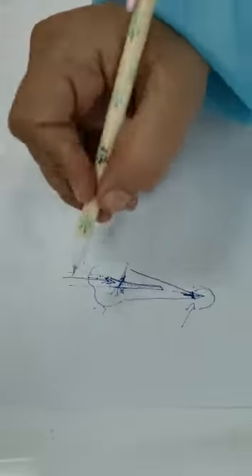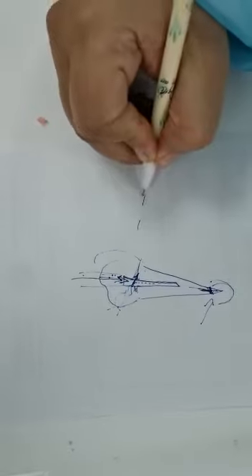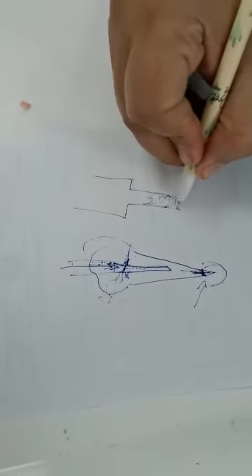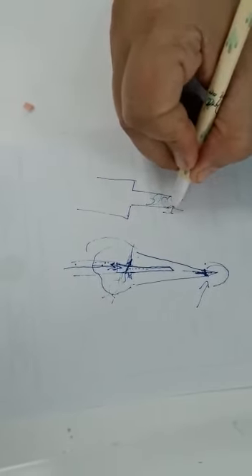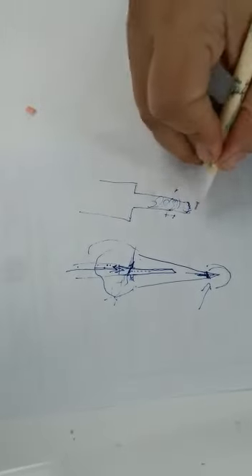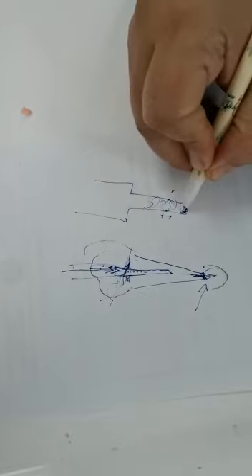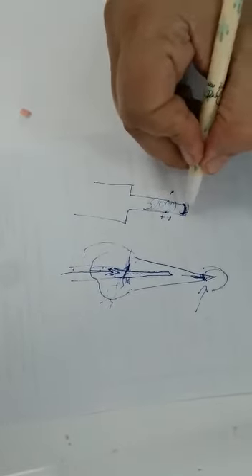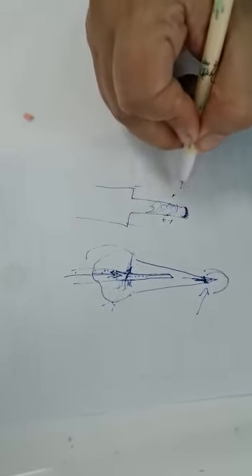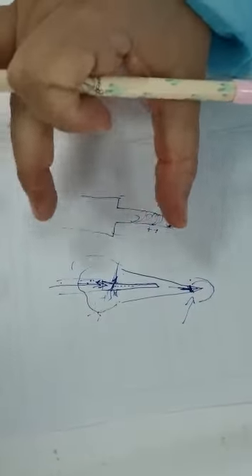Okay, there is a second method where some of the post systems provide you with a post removing burr. This burr has a specific morphology where it has a safe end in the sides. It has safe sides and it works here. The serrated surface or the rough surface is in the lower part, and it has some mechanism where it keeps this central in the root, so it doesn't go to the side here and side here. Okay, these are specific post removing burrs.